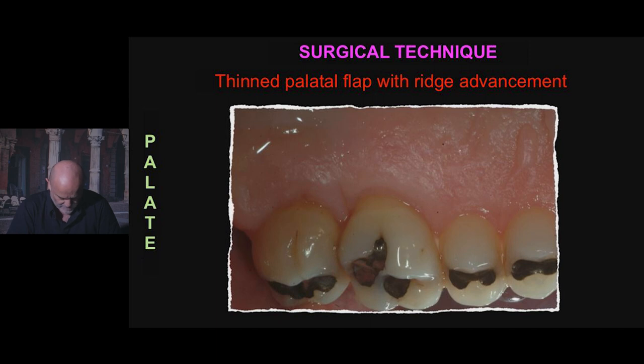The thin palatal flap is a split thickness flap which has a dual purpose of thinning out the soft palatal tissue and obtaining its apical repositioning, without the possibility at palatal level to use the alveolar mucosa — the vestibular technique for apical repositioning of the flap with periosteal anchor and suture.